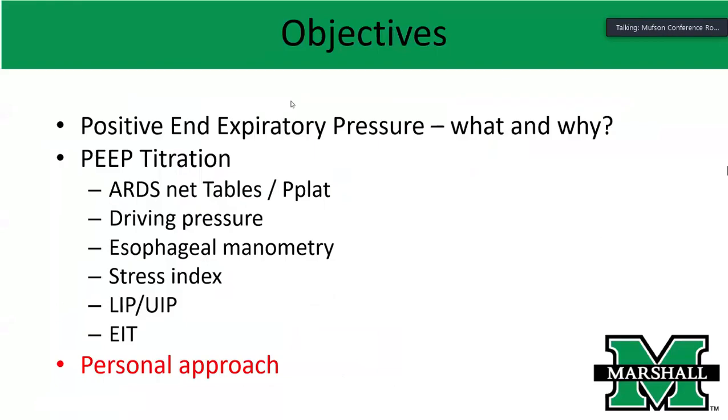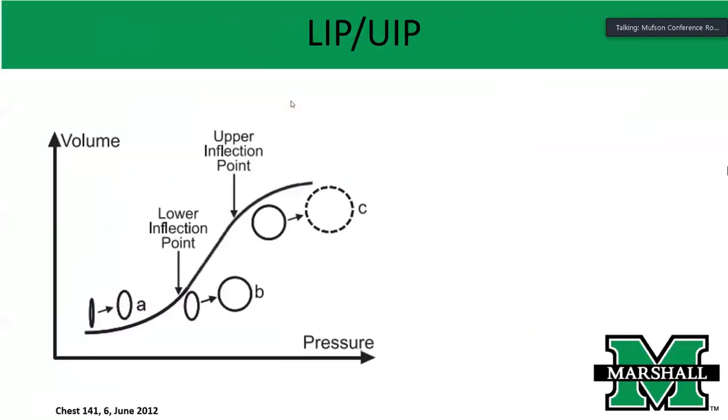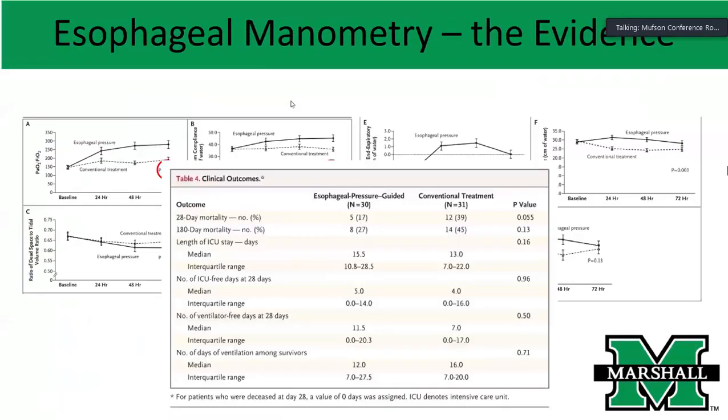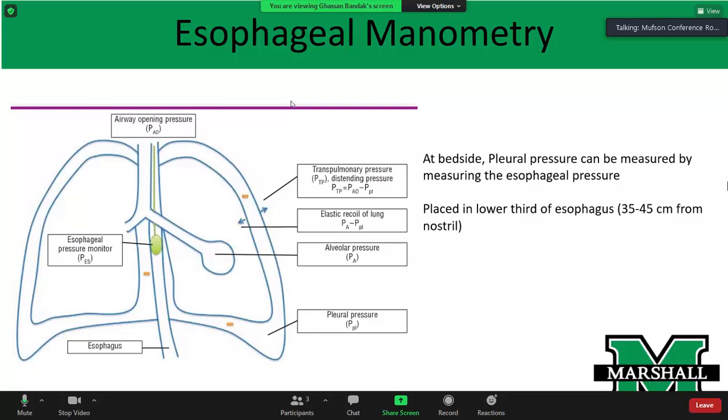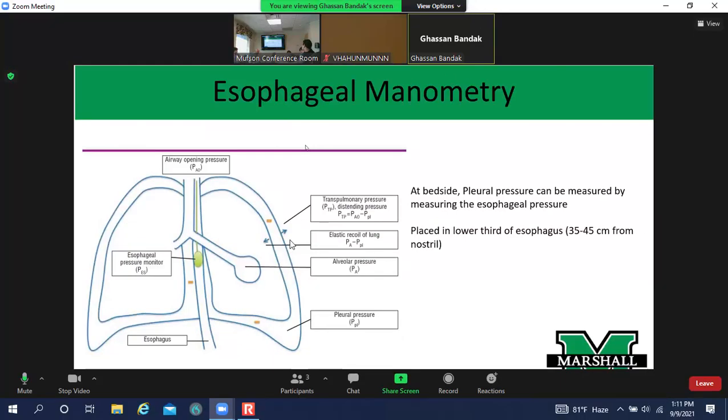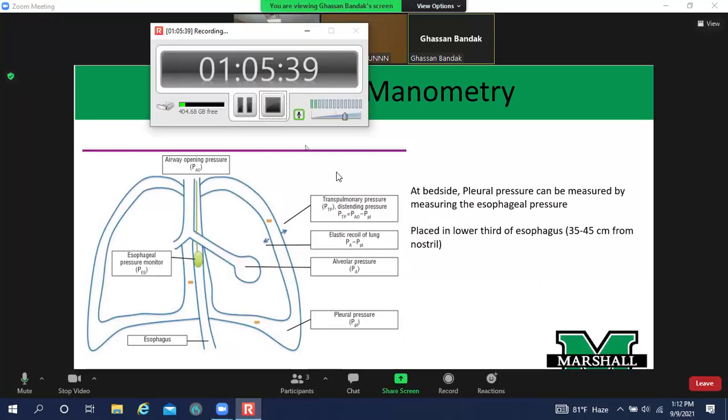Yes, please. On the esophageal manometry, the way that you explained it, in a way or another, the goal is that the delta pressure is summing up the factor of the mass and the wall and deformity, etc. So I was just thinking, if you have an obese patient, okay, let's say you're using a high PEEP of 10 or 12, 14, a PEEP that technically you cannot extubate in, but your esophageal pressure, let's say it's 0 or 1.